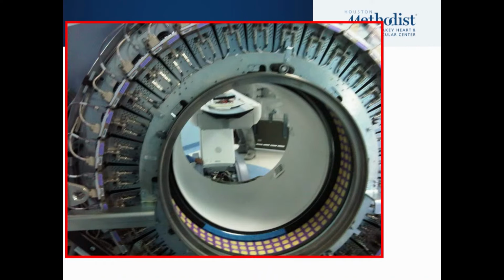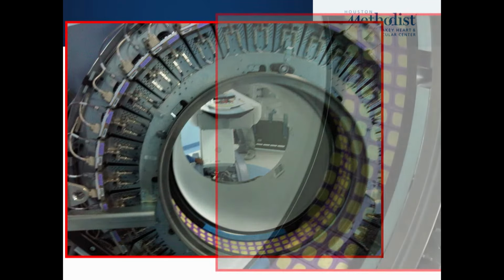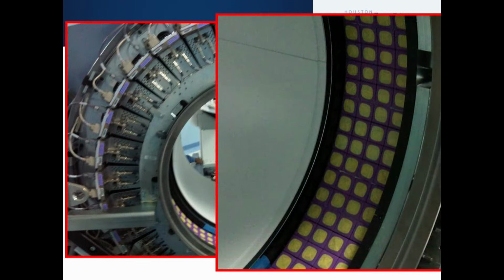So in comparison to SPECT, where we're imaging the patient from the front, with PET we have a full ring of detectors around the patient. If I zoom a little bit more here, now you see these rings. Each one, you see this small square there, and each square has an imaging unit.